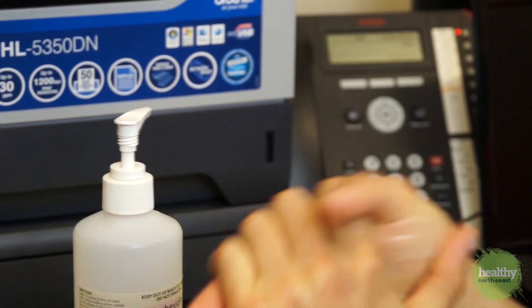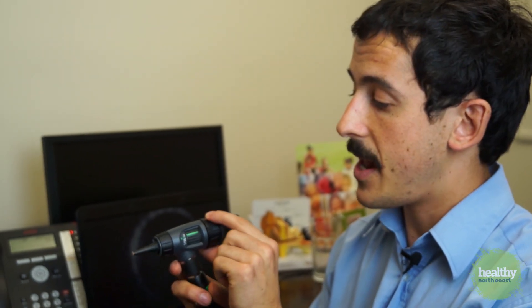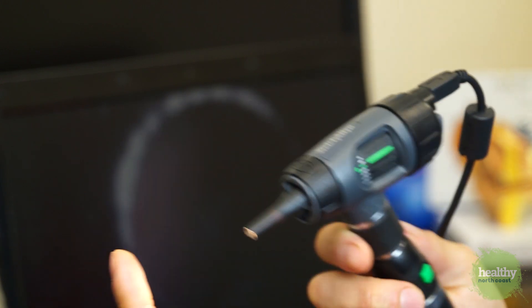Next, I would usually explain to the patient — in this case a young patient — that we're going to put their ears on TV. Explain to them that the procedure won't hurt but it will feel a little bit funny to have something in their ears. Wash your hands, make sure the otoscope viewer is turned on, and that the light on the otoscope itself is turned on. You'll also notice that this otoscope has an automatic focus.